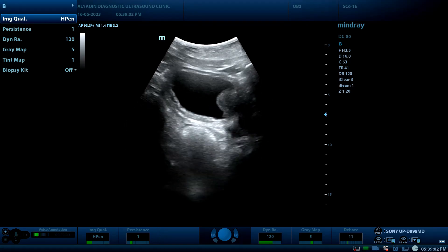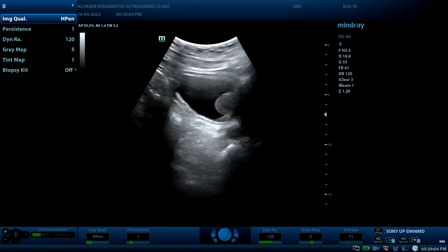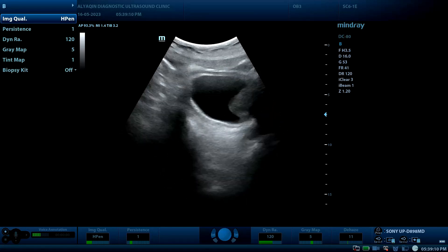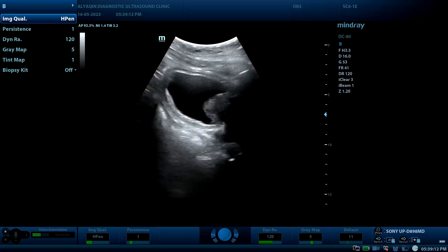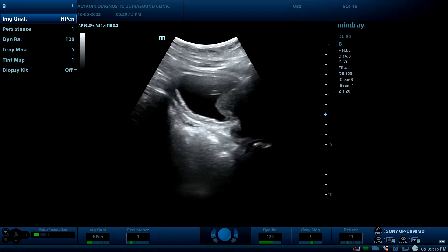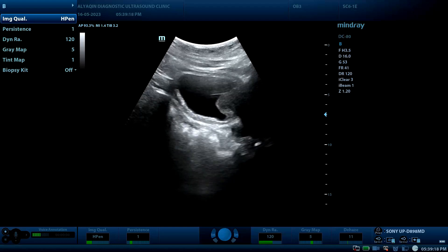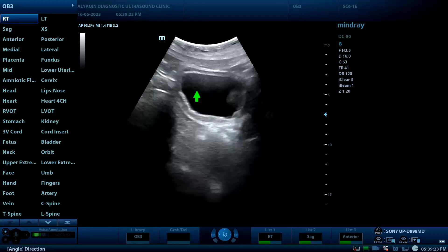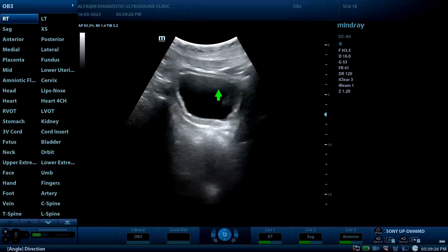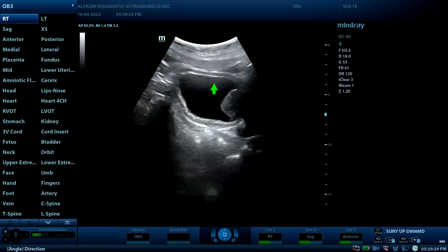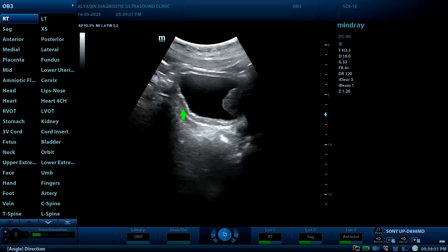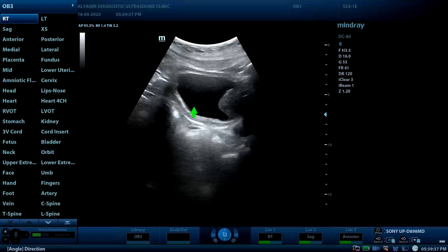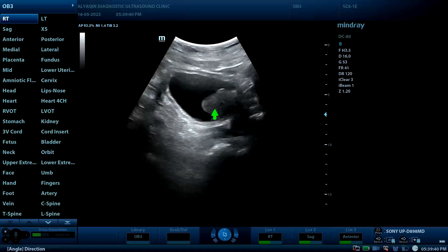57-year-old male with history of dysuria and urgency. This is a post-voiding exam performed at the suprapubic region. The urinary bladder is partly filled and shows a thickened multi-layered wall with signs of cystitis.